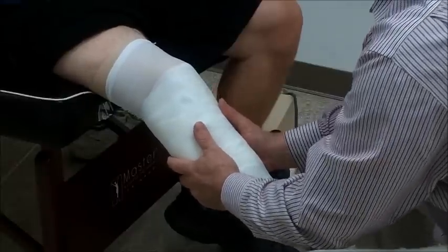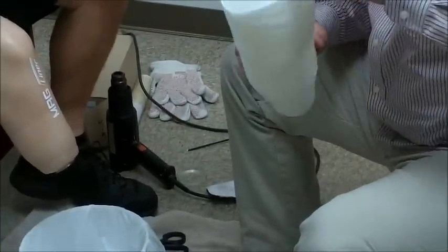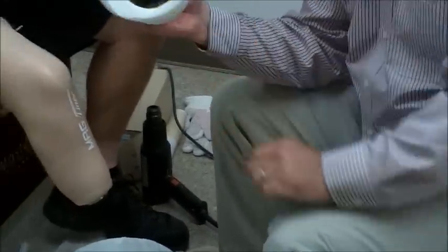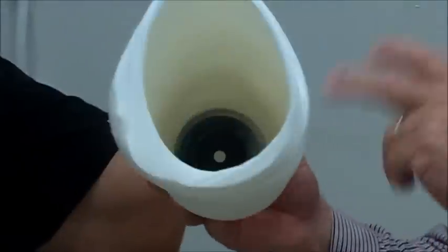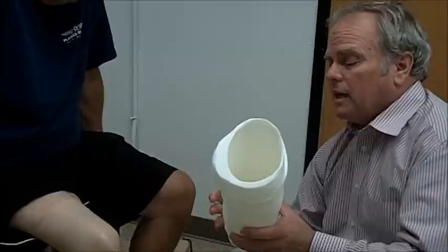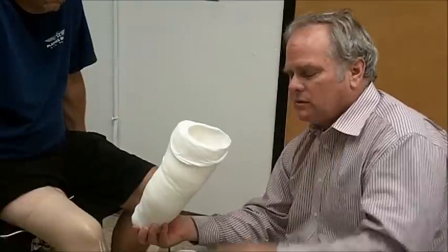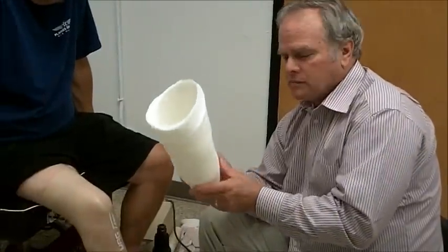So relax your leg. Inside of here — let's see if I can roll this out and show you — is the dummy. I could fill this right now and say we're good to go. What I could do is leave the dummy in there when I fill it, or I can take the dummy out and do it that way. If you're going to fill it and leave the dummy in, take the silicone out so that your model comes all the way out and has all that flare built into it for your laminating.